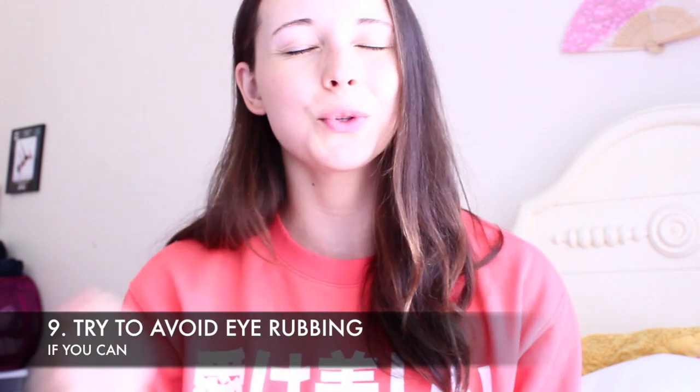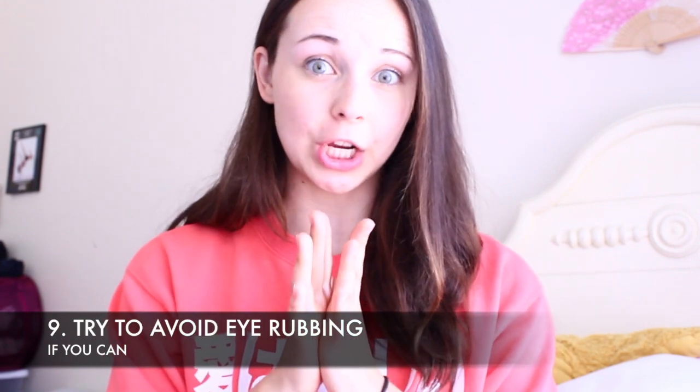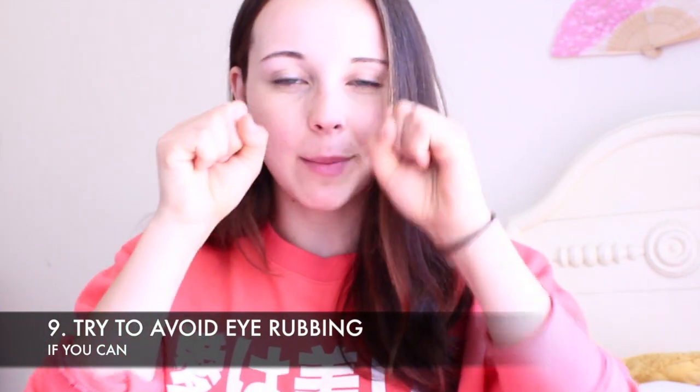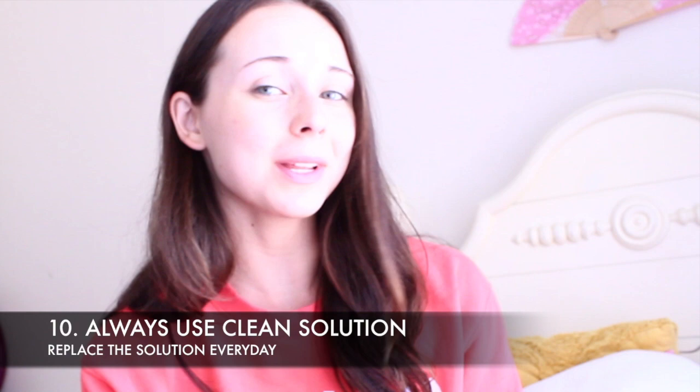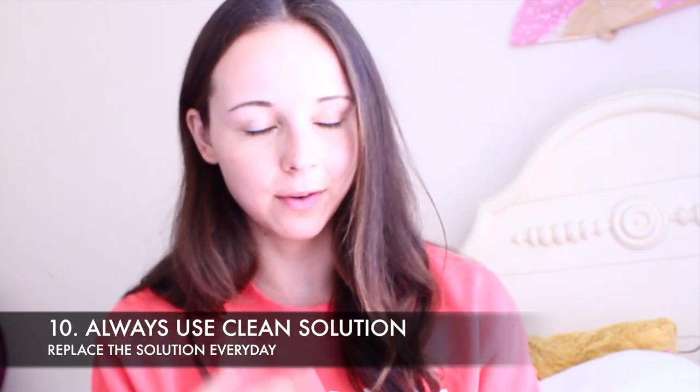Another tip I have is to please avoid rubbing your eyes. I know it's like a huge habit, especially if they're itchy or something, to just like start smudging them everywhere, but it's not good for you or your contact lenses, so just please try to avoid that if you can. Another important thing to think about is always just making sure that your contacts are being soaked in clean solution. So not to reuse the same solution over and over again. That solution may build up like bacteria and some dirt particles, so always making sure that you're doing some new solution so it's nice and clean for when you put it in your eyes.